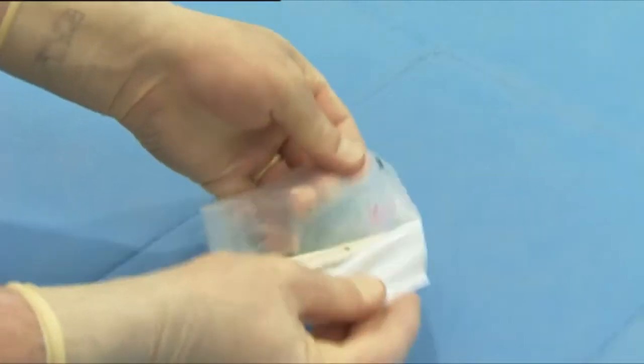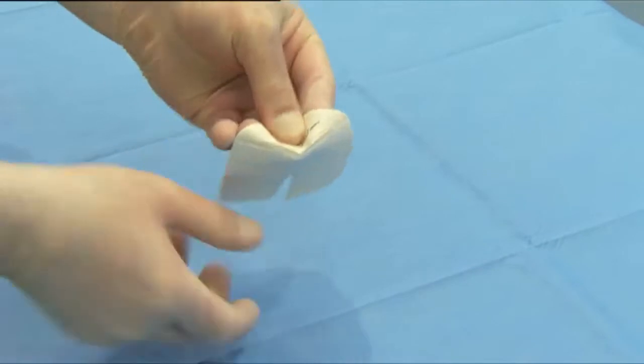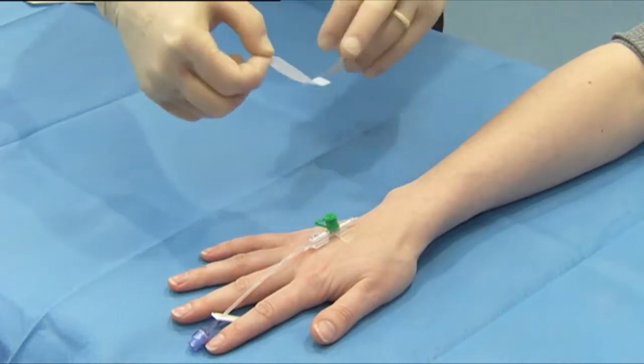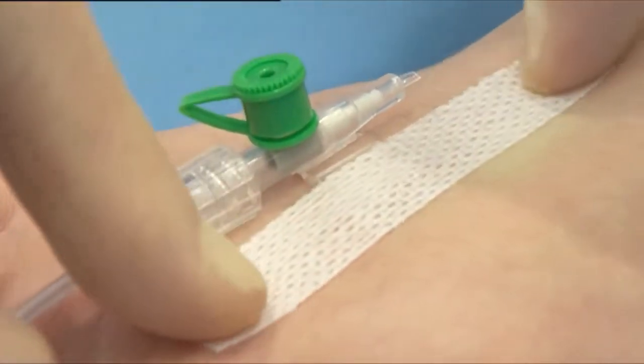Peel open the package and remove the sterilised dressing. Remove the centre cutout from the frame of the dressing. Remove the sterilised securing strips from the centre cutout. Place the securing strips over the catheter wings for added security.